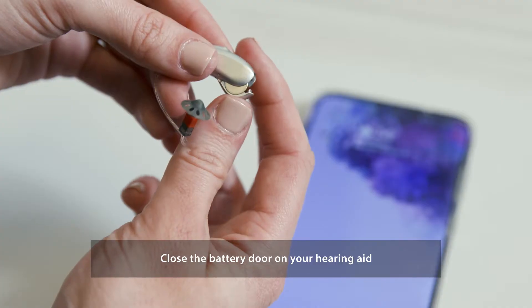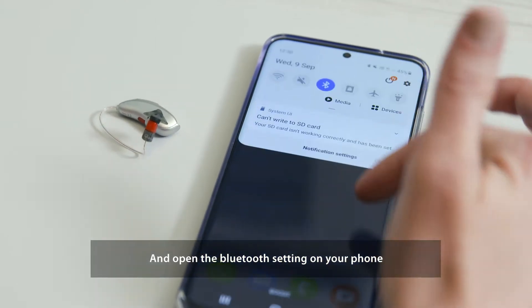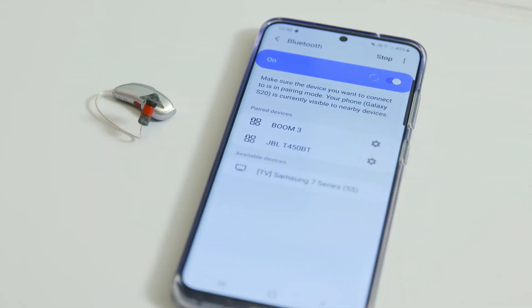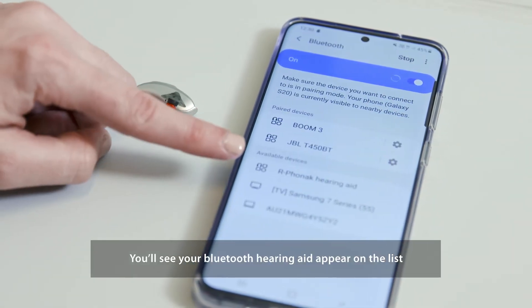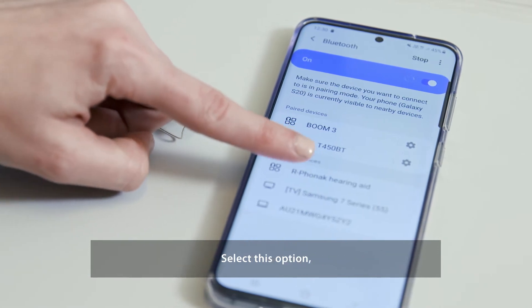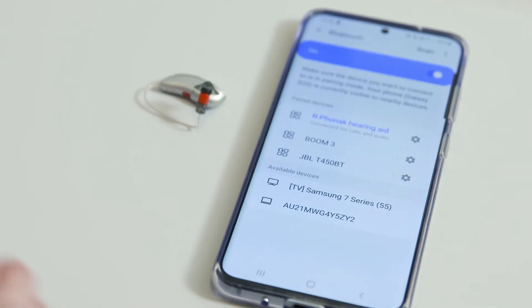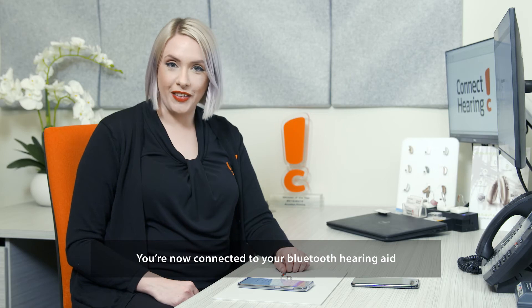Close the battery door on your hearing aid and open the Bluetooth settings on your phone. You'll see your Bluetooth hearing aid appear on the list. Select this option and your phone will pair. Hit OK to the pairing request. You're now connected to your Bluetooth hearing aid.